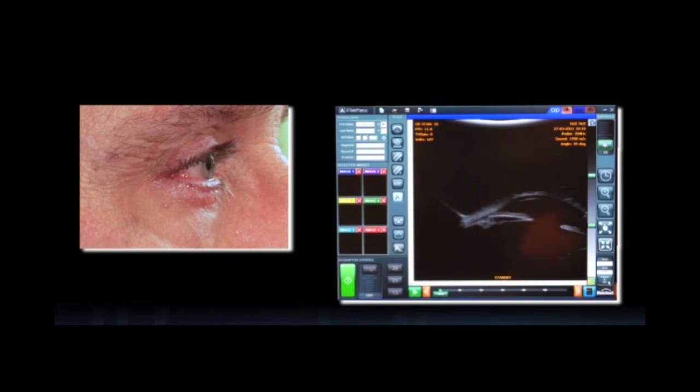So, in looking in the screen here, before we do any alteration of contrast or brightness or magnification, here's the edge of the bag rolling off the side of the eye. Here's scleral tissue. This line right here denotes a different type of tissue, uveal tissue here, and that's a line right there. Here's a ciliary body. You can see the sulcus. Here's the iris. Here's some zonules. Here's the posterior aspect of the cornea, endothelial cell layer. Up here is epithelial. Notice there are some of those wrinkles that I had talked about before.